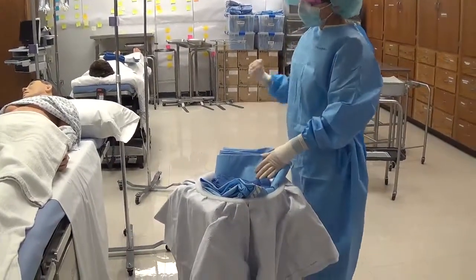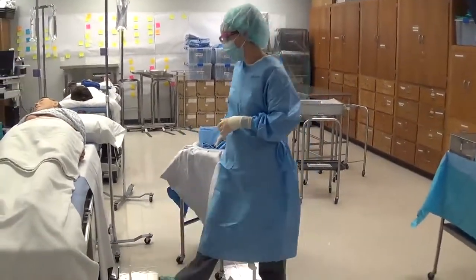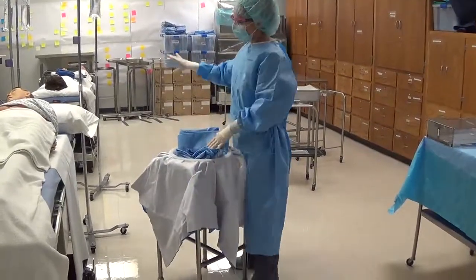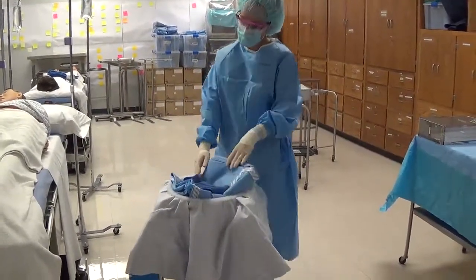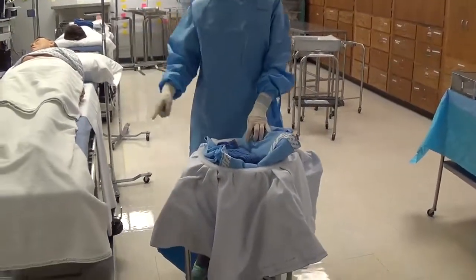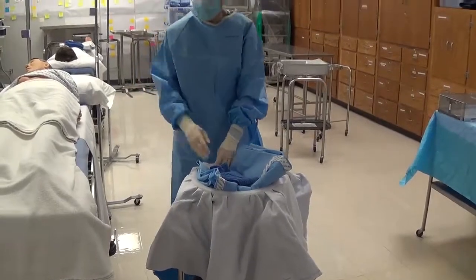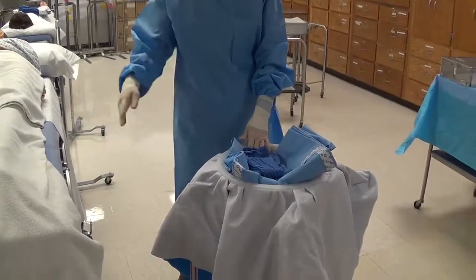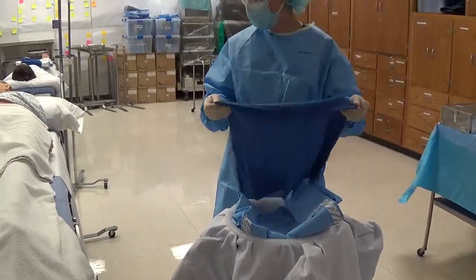I always suggest students bring the basin to the feet instead of the head, because toward the head it usually ends up behind you as you're placing your square-off towels, and there tends to be a lot of equipment up there. Bring it toward the feet, but remember we have to keep it a safe distance — 12 to 18 inches — away from anything unsterile.